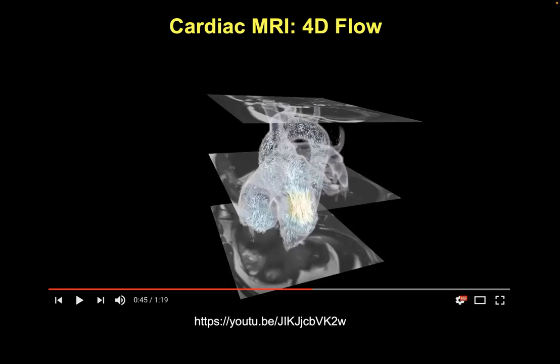And so there's a lot of X-ray guided surgery. There's a lot of ultrasound guided surgery. But the frustration is that the images really stink, right? And then you can't really see the soft tissue in the fluoroscopy or X-ray guided surgery. So under certain conditions, if you're putting in a device and it's easily made MR compatible, and it's really important to understand the soft tissue environment you're in, then MR should be available, right?